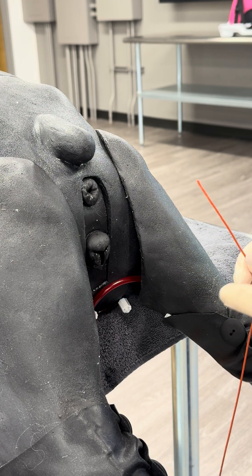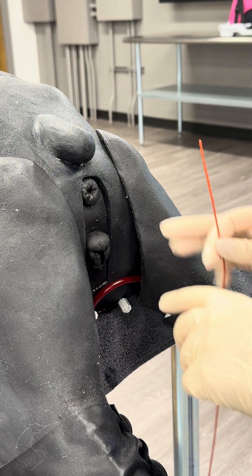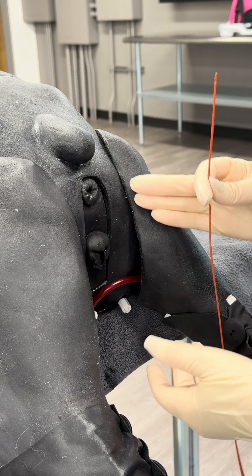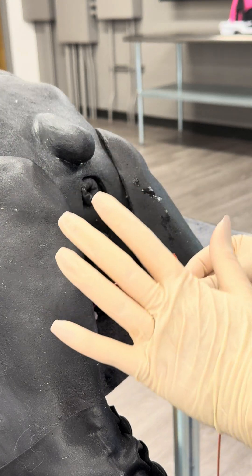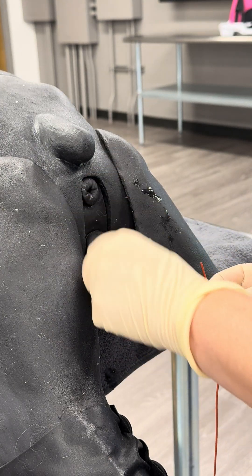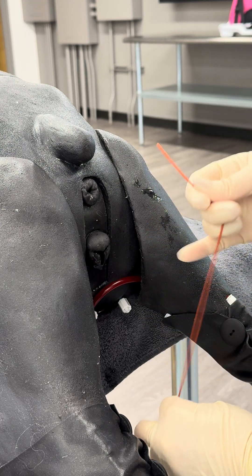Positioning is really important when you're doing female catheterization. I find the most luck when they're in sternal recumbency like this. You can also do it in lateral recumbency. I've got my sterile gloves, I've prepped with chlorhexidine or betadine, and I've flushed the vaginal vestibule.